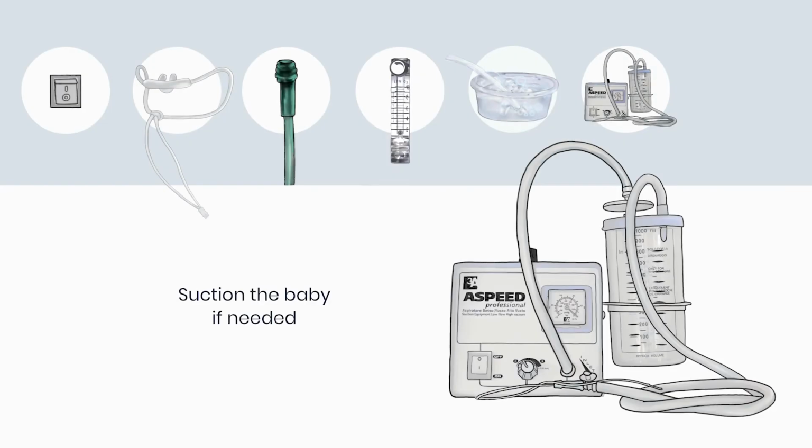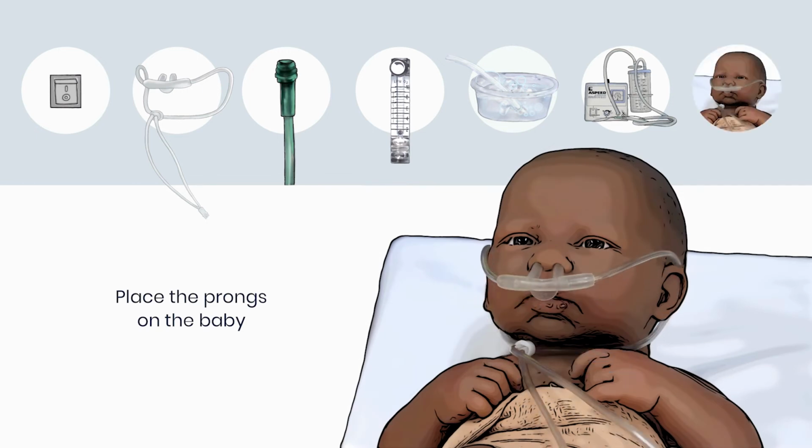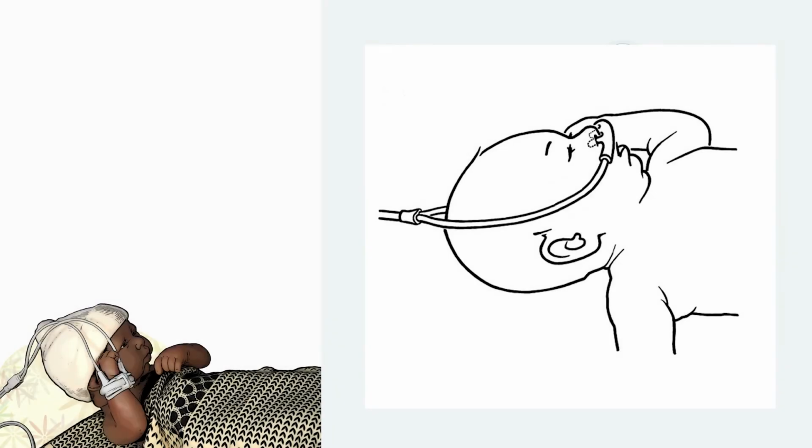Check that the baby's nostrils are clear. If not, you need to suction. Finally, you can attach the prongs to the baby. There are 2 ways of doing this that are commonly used. The first, which is recommended in the World Health Organization guidelines, is to place the prongs with the slider behind and away from the baby's head. The prongs should also be secured on the side of both cheeks with plaster.